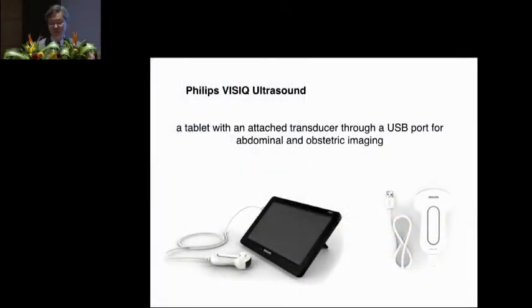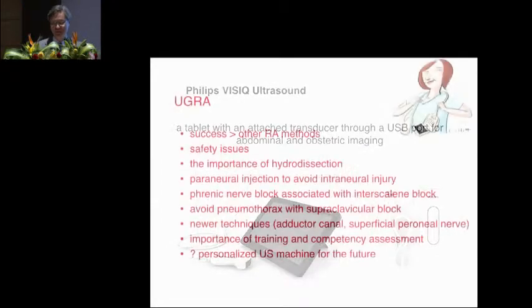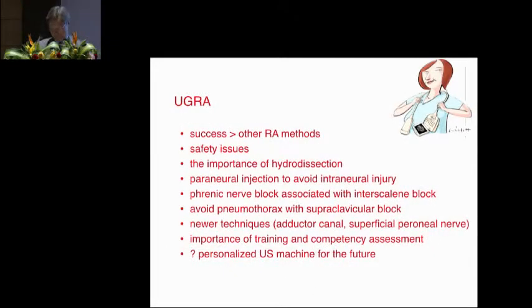And also other companies will come up with tablets. So I hope I have emphasized during this lecture the success. Yes, ultrasound can improve our success rate. For those people who are skeptical, I encourage you to learn the technique, to really test it out. It's not just looking at what randomized controlled trials tell you, but your personal experience is the most important. If it works in your hand, that makes the big difference.